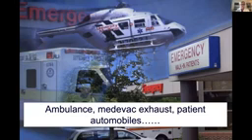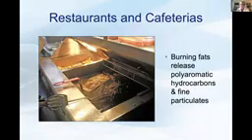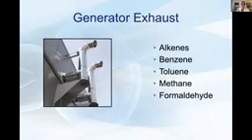Again, these were not near our air intake, but still were contributing to some of the VOCs and viables that entered our space. General traffic exhaust, restaurant cafeteria VOCs generated from that, whether it be within your hospital or a neighboring restaurant down the street. Generators, whether this be the generator belonging to the IVF lab or the hospital, these typically exercise on a weekly basis. So on a weekly basis, you're going to have a continual release of embryotoxic VOCs.